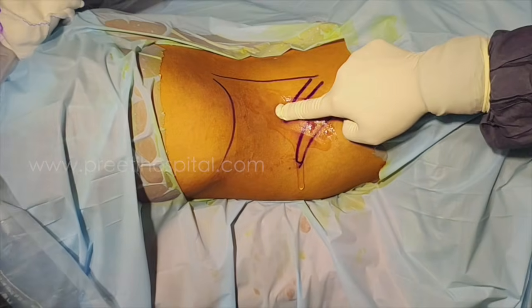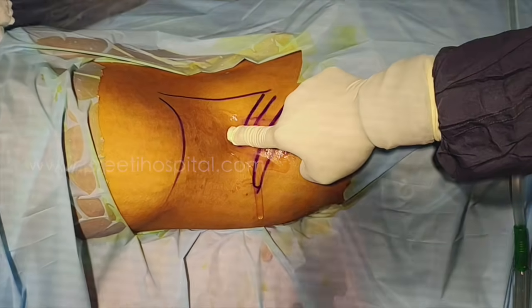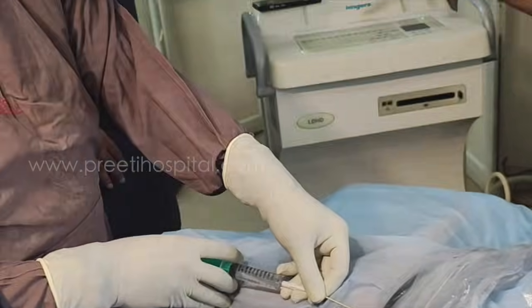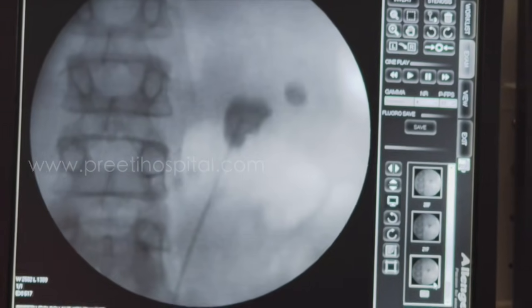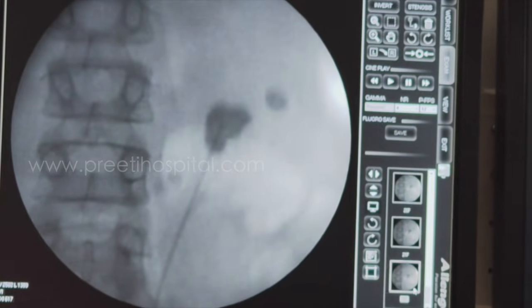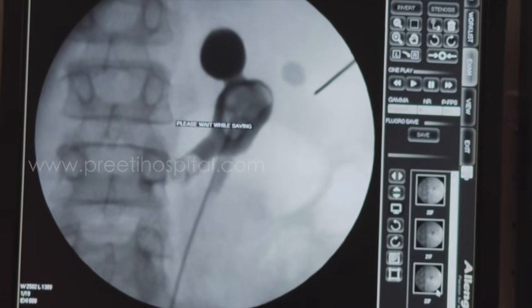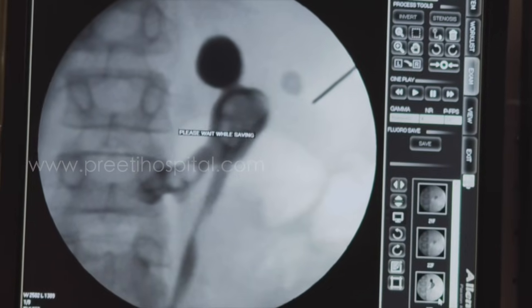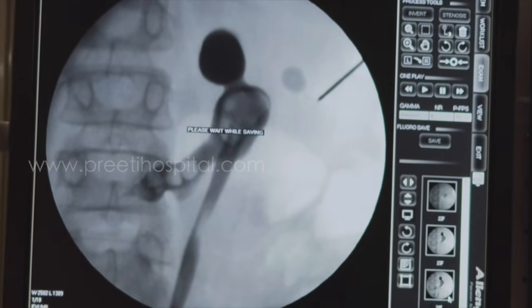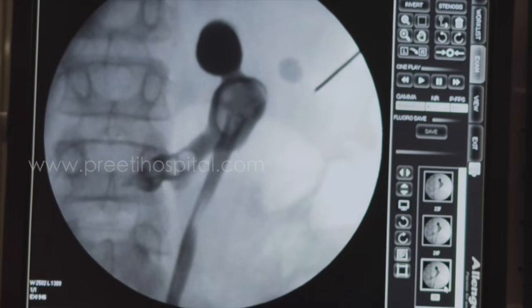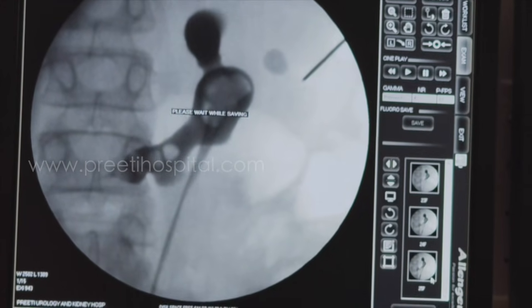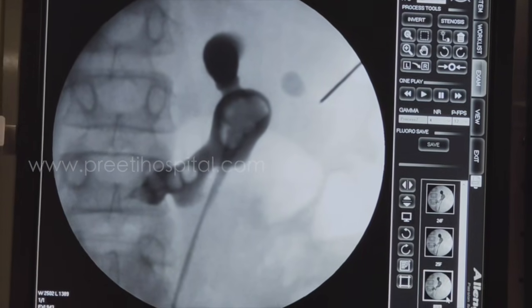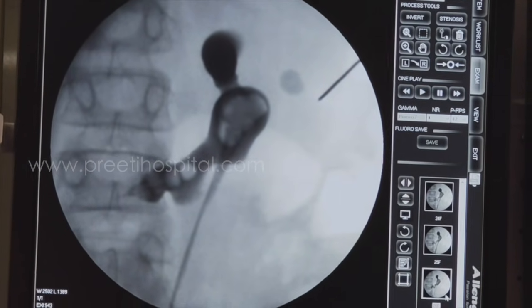You can inject the contrast now. Here I have marked — it will go like this. Exactly it is coming to that region. That calyx is not communicating that much. Actually, Sandhra is saying the lower calyxal stones — three stones have moved, freely moving from the lower calyxal stones. So if we hit this stone and go, I will get access, because it is the most posterior.